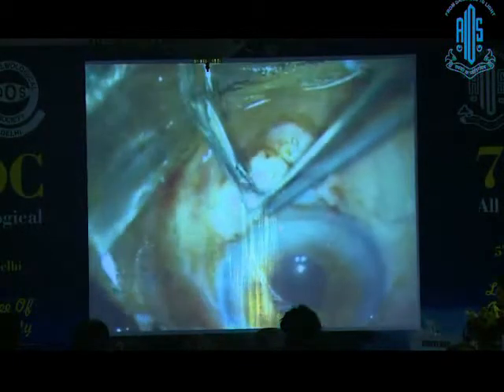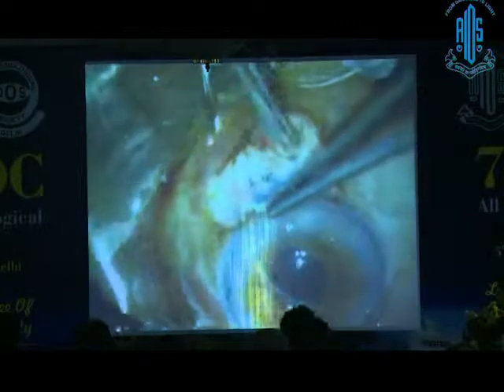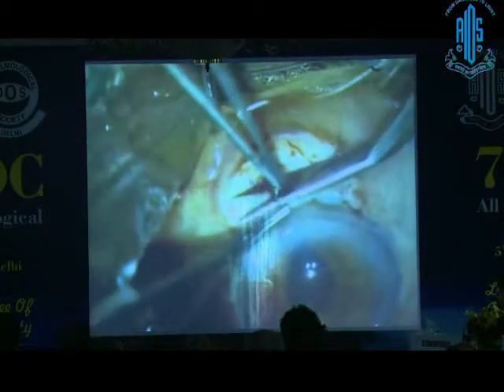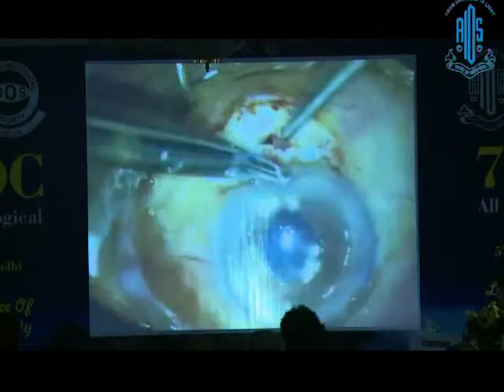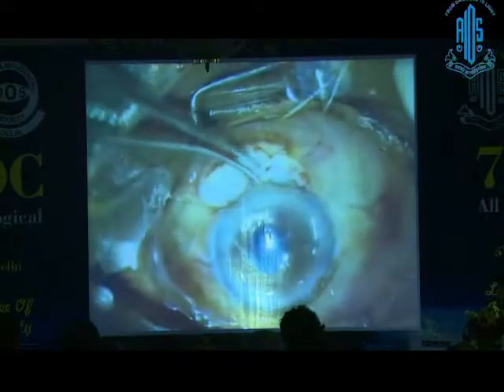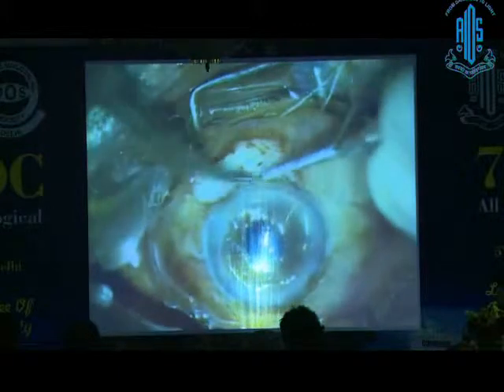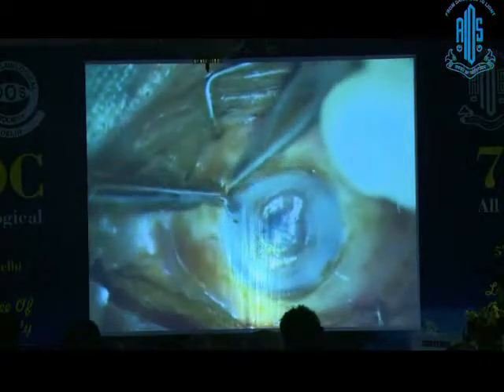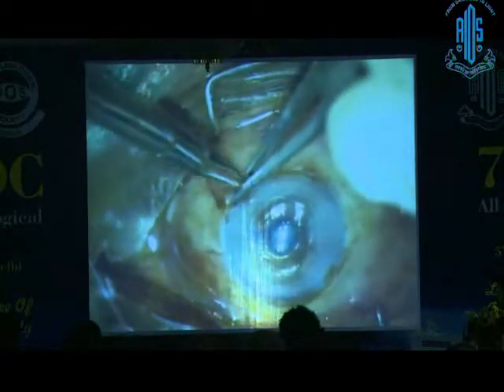These are two small vertical cuts. You can make them with a small lancet or even with a needle. Once you make them, no need to use any punch — neither a big punch nor a small punch. Then you suture the flap for trabeculectomy. Since the incision was frown, we made the flap on top of the frown for the trabeculectomy, so this will remain suture-less.